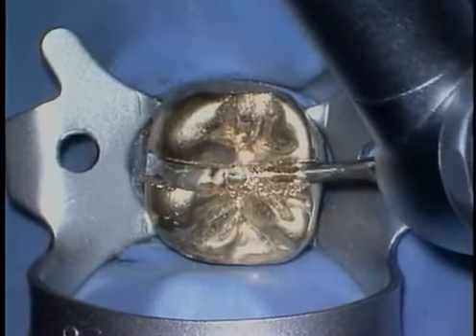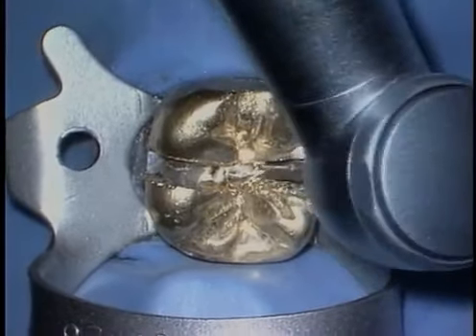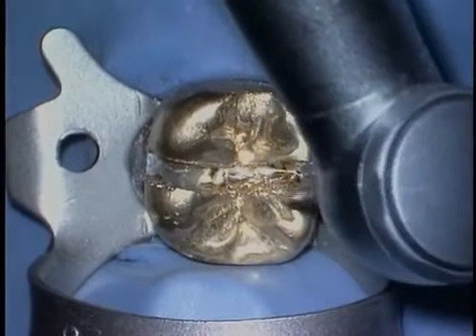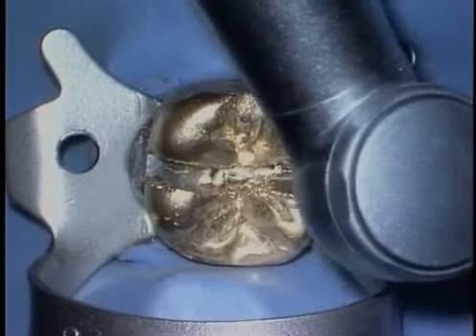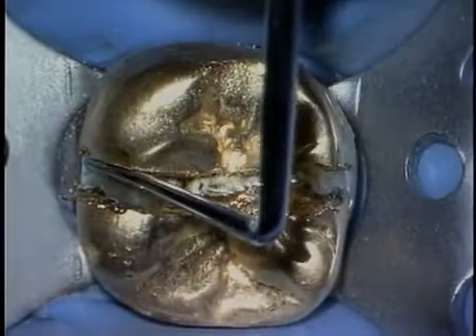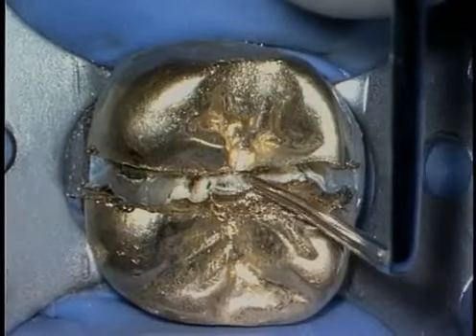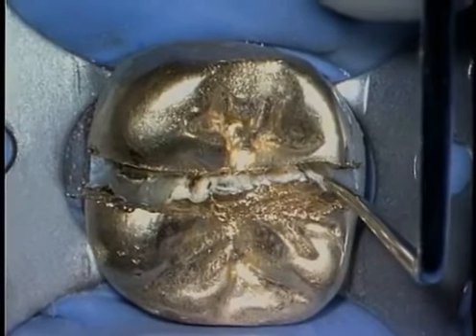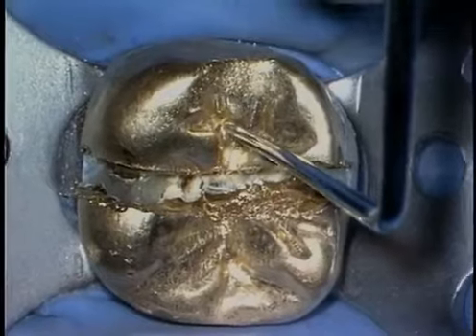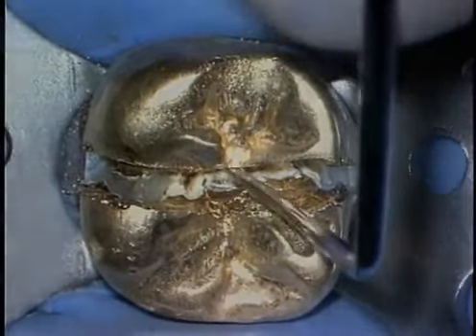What we want to do is carry a slot across the top of the tooth. Once the slot has been created, then we can think about placing a crown splitter into this groove. Be careful to stabilize the burr and have a good fulcrum because you don't want to skate off the tooth and inadvertently injure the patient. Assess your sectioning and make sure you're completely through the metal from the buccal to the lingual. If that's the case, then the sectioning tool can be placed in between the mesial and distal halves, and then we can generally dislodge one or both halves.